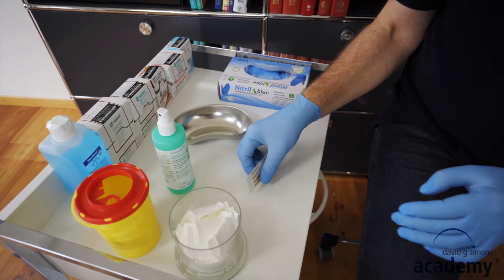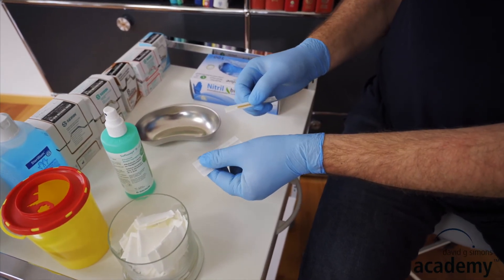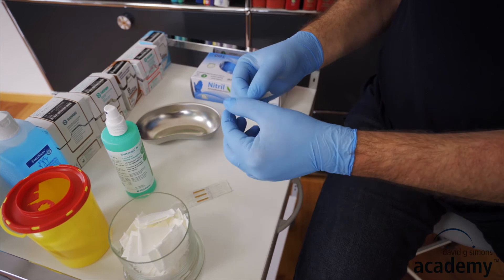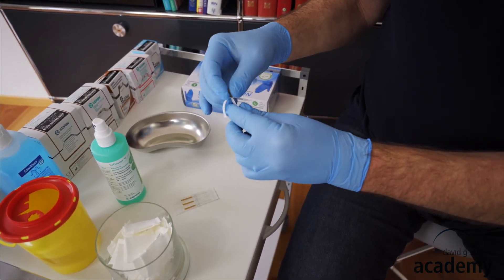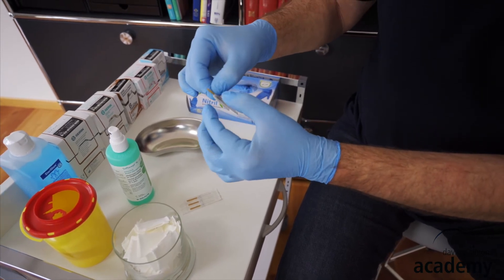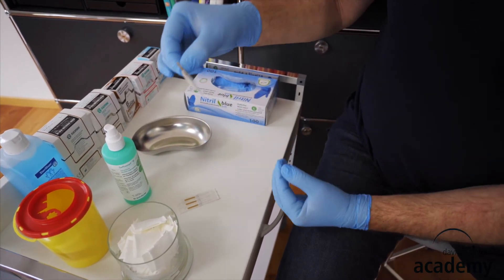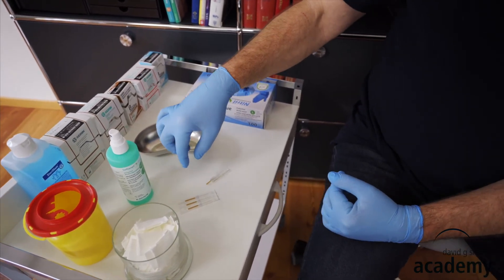Now I'll show you how to open the needle. Take them apart like that — that prevents bending. Then open the needle package only down to the grip, not down to the needle. That way the actual needle is still protected. Then you can place it on the trolley.